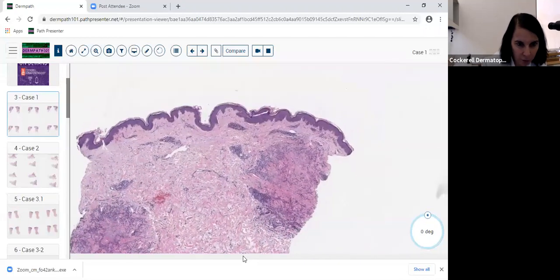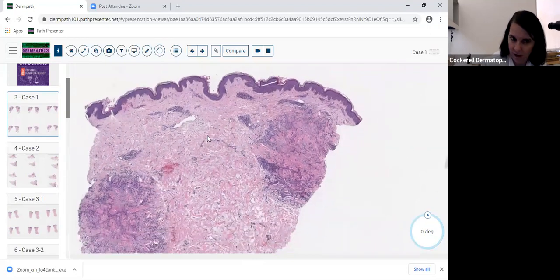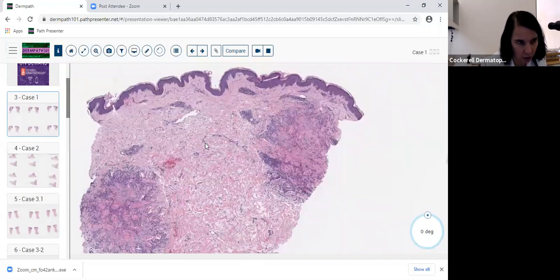Obviously they can be a perforating type, where you can have transepidermal elimination where they'll try to actually eliminate the dermis where this inflammation is. You know, the subcutaneous type of GA can very much mimic a rheumatoid nodule. So you have the interstitial GA. Now interstitial GA won't have ill-formed, if at all, palisades. There'll be no palisades, it'll just be interstitial histiocytes.